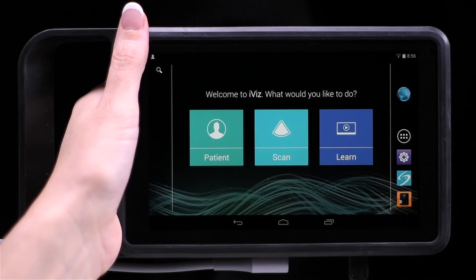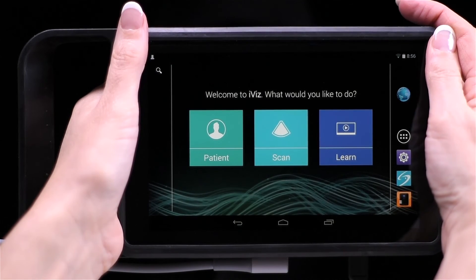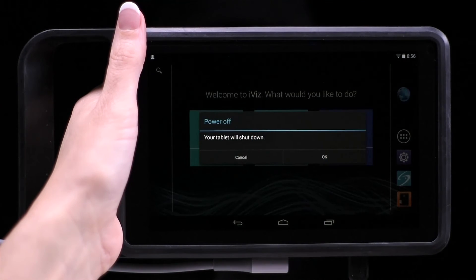When you are done using the system, you can either press the power button to put it to sleep, or press and hold the power button to power down completely. When prompted, tap Power Off, and then tap OK.